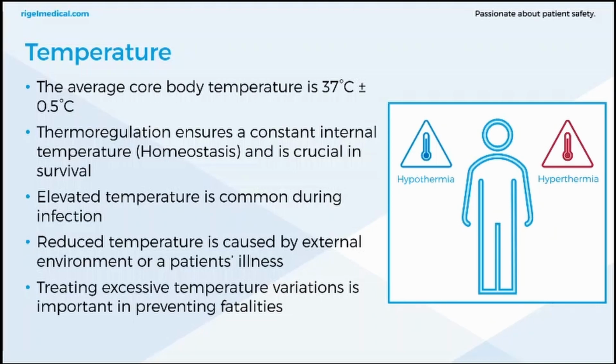Then we've got temperature. Again, this is one of the most monitored vital signs. You've got several devices which monitor and measure temperature over the years. So you've got things like mercury filled thermometers, though of course they're no longer available due to the toxicity. There's resistor-based sensors, and even non-contact infrared-based temperature sensors, which have become much more commonplace again since COVID-19.